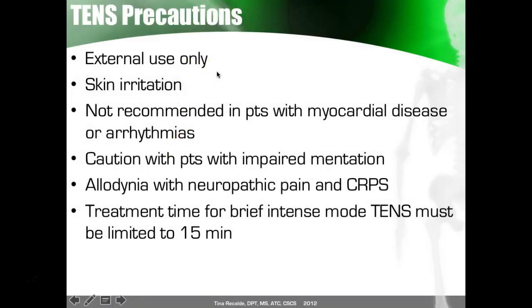Precautions: it's for external use only. There are special types of biofeedback and electrical stim used internally, but the regular TENS unit is not for that. Somebody who has skin irritation, so if you've used this and they had a reaction to the pads, you're not going to put this back over those pads. Or if they had, say, some kind of skin rash, you're not going to put the pads over those areas. It's just going to irritate them.